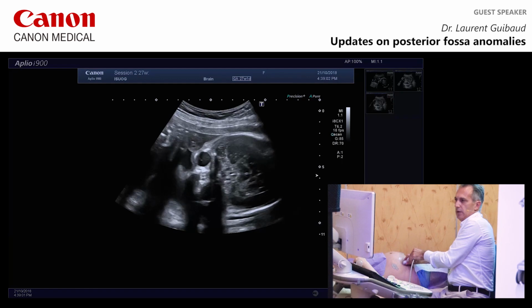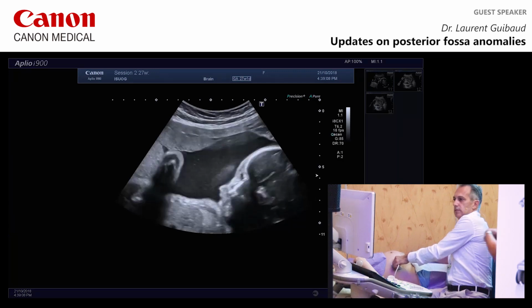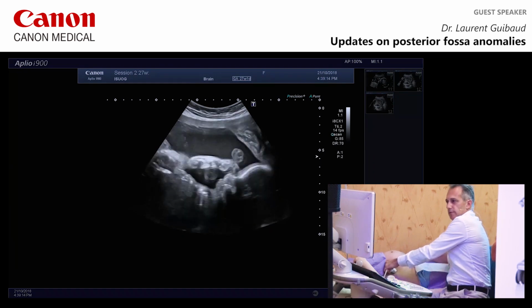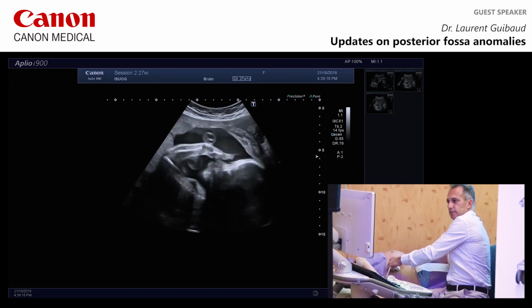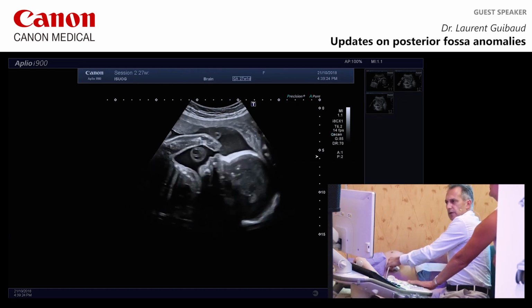You can see clearly the eye. Try to be a good boy. So you see at least the corpus callosum.